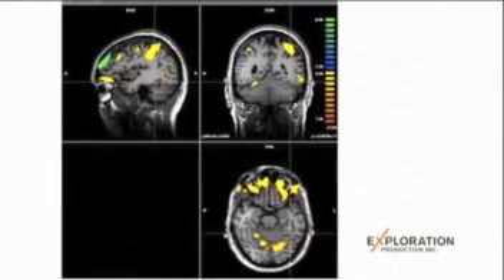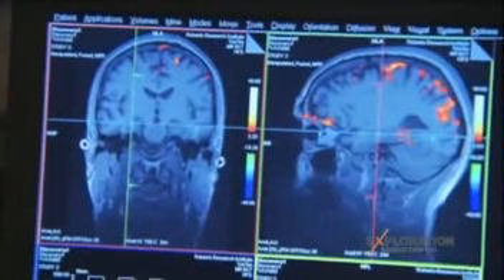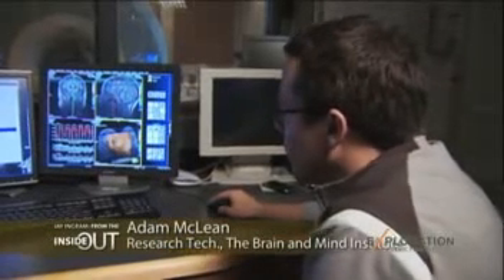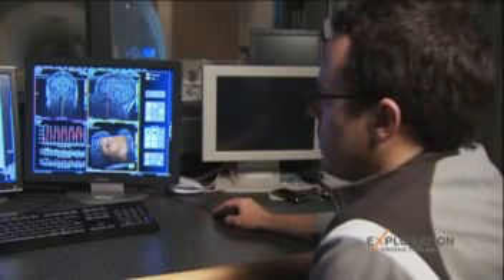I'm staying perfectly still — not even holding a racket — but the supplementary motor area, the part of my brain that controls movement, is lighting up like a Christmas tree. At the beginning when he's not imagining a task, we get a baseline of activity, and as soon as he starts imagining playing tennis the brain activity in the SMA increases. Then once he stops, during the rest period, it drops back down again — you can see over time how his brain was thinking about playing tennis.